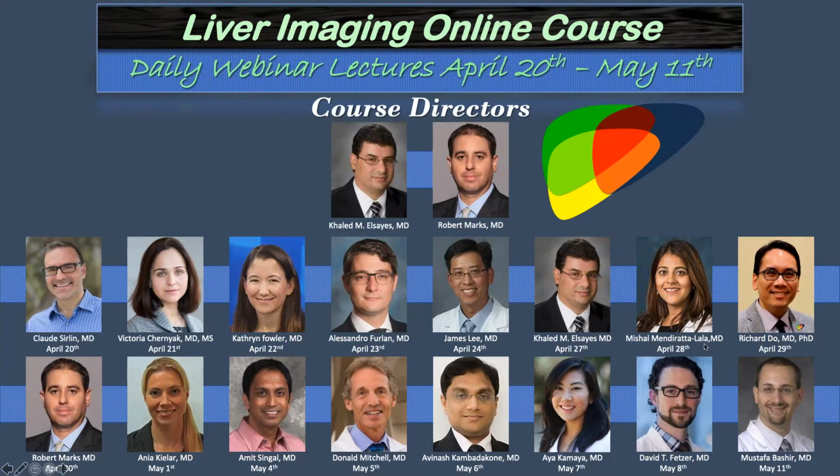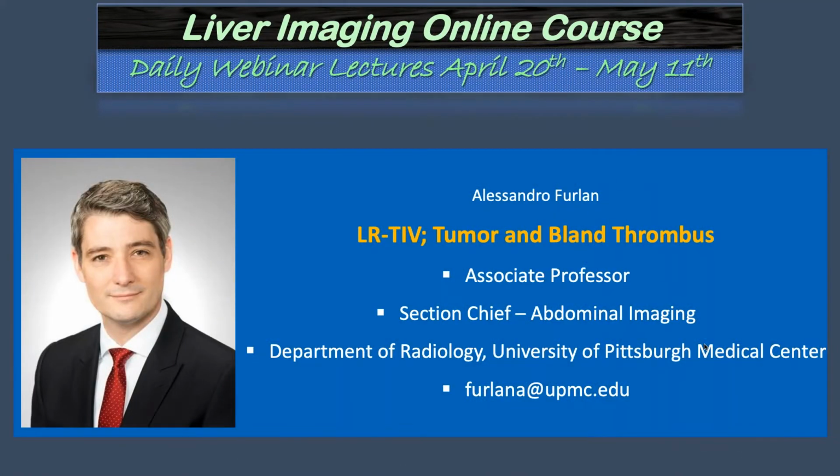I'm sure they're going to go in depth into this analysis. What I would say is that we are looking at the same features, meaning the enhancement of the thrombus, as the main features leading to the diagnosis of residual viable tumor after locoregional treatment.